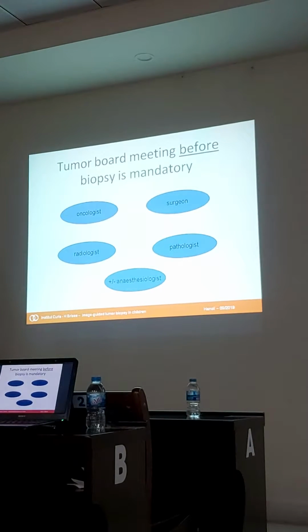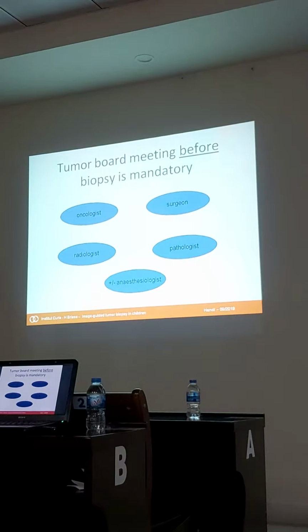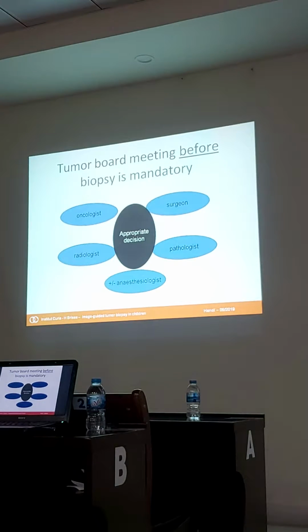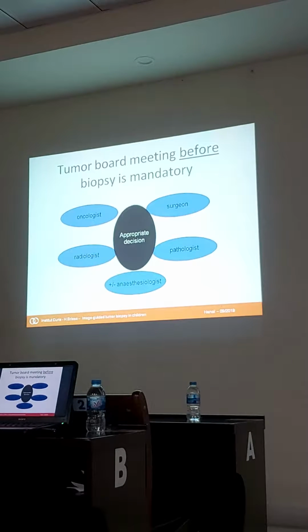So I come back on the biopsy. You have seen all the situations when you should not perform biopsy. Now we should discuss the biopsy. It's always mandatory before biopsy to discuss in a multidisciplinary approach with oncologists, surgeons, with the pathologist, and of course anesthesiologist.